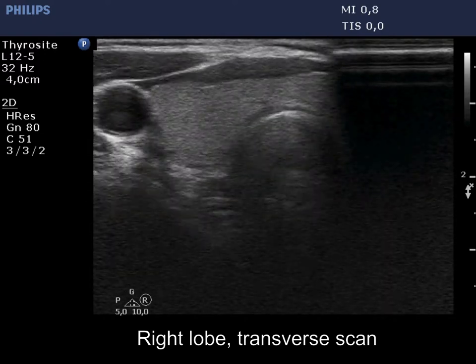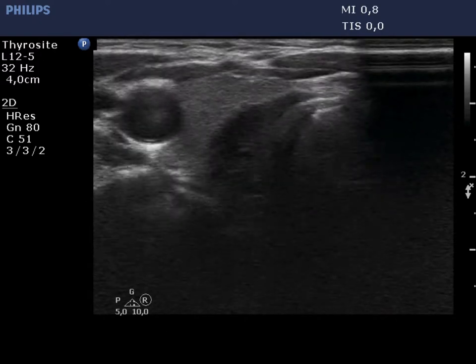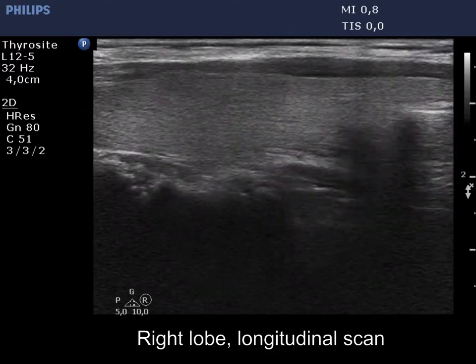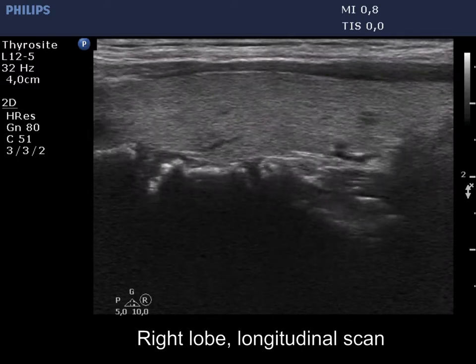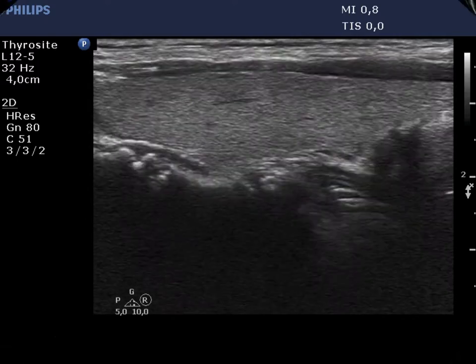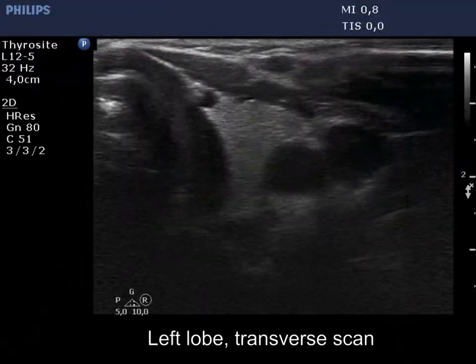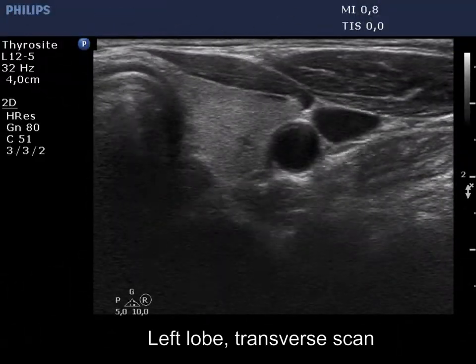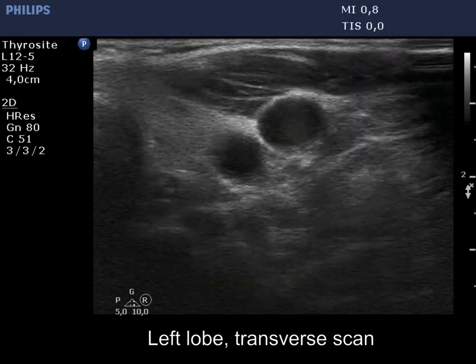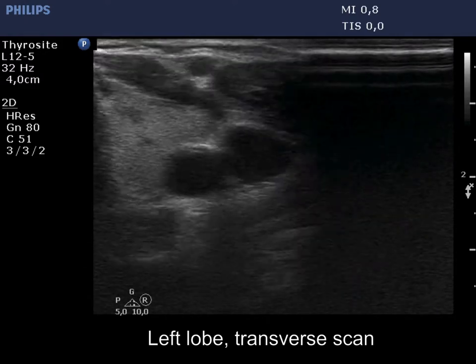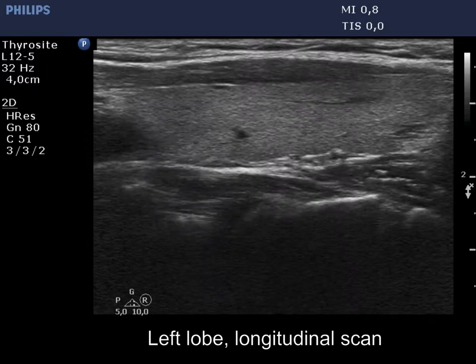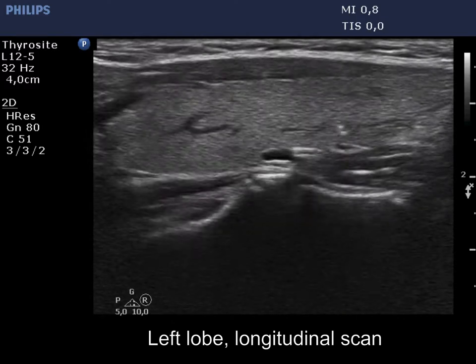The right lobe is ecographically normal and has no discrete lesion of oncological or clinical importance. The presentation of the left lobe is similar. There are no signs of an active autoimmune thyroid disease.